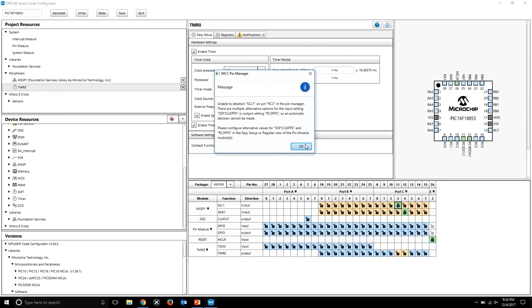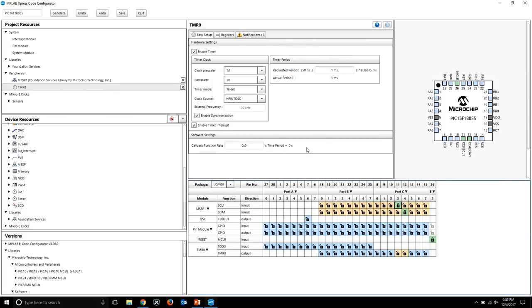No, so what we're going to do here is move the pin around, because by default you have to have two pins for I2C to work. So we're just going to use a little trick. I'm going to move this RC3 to maybe RC5, right? And it lets you move. And you can see all of those pins are orange. So just one got selected and everything else got deselected.